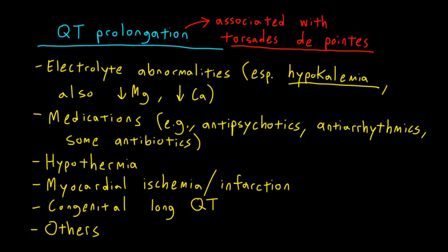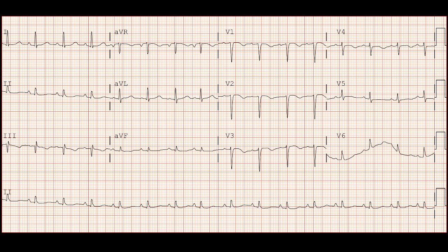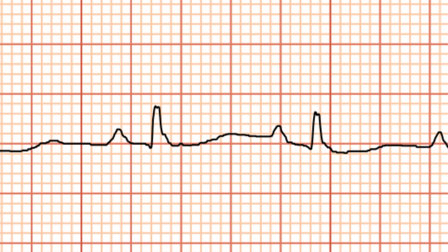Now, let's go ahead and look at the intervals on a couple EKGs. So, looking at this EKG, let's start with a PR interval. It looks like I can see the PR interval pretty well in the rhythm strip, which is lead two at the bottom. And so, let's take a closer look down there. Remember that we measure the PR interval from the start of the P wave to the beginning of the QRS complex. And so, you can see it over here. And it looks to be pretty normal.